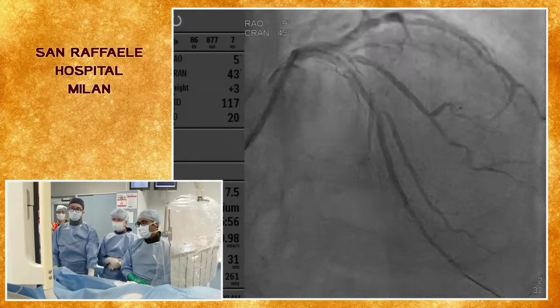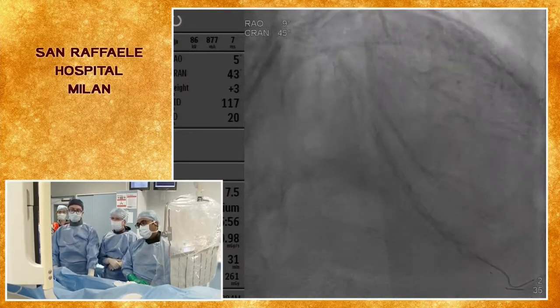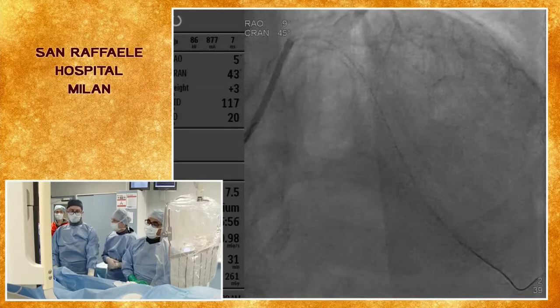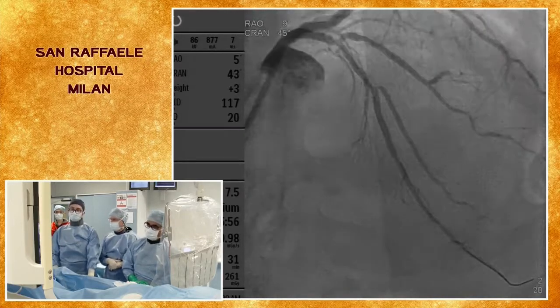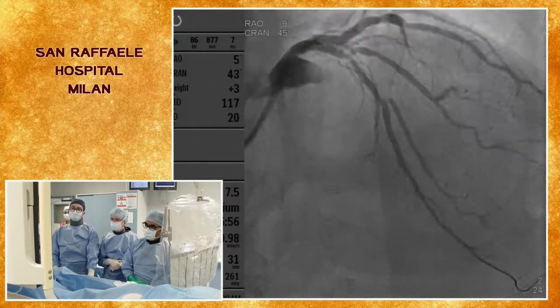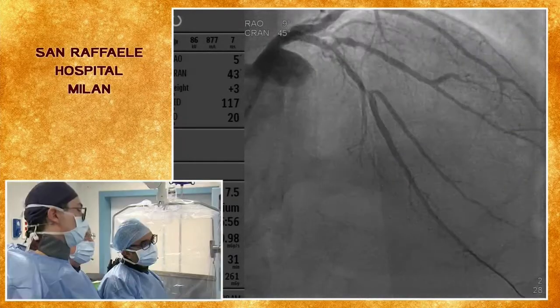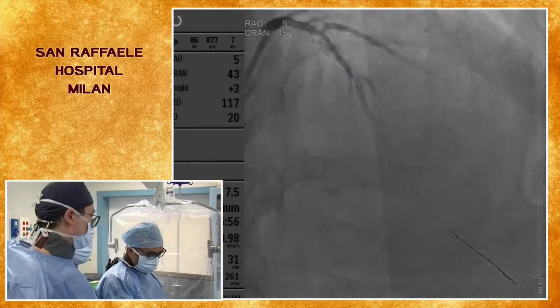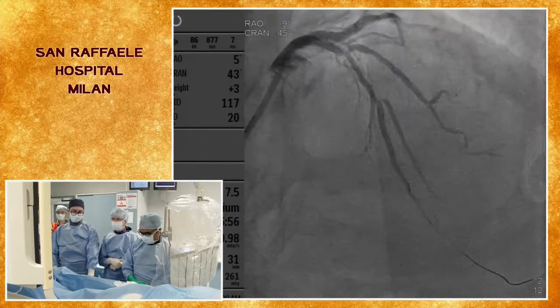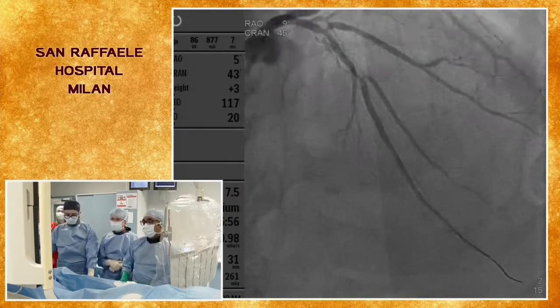So our approach is a little bit unconventional in this case because it's not common. My suggestion was to do a single stent from the LAD towards each diagonal, and then maybe consider a drug eluting balloon in the distal part of the LAD, in order not to place two stents. Of course, the final decision will be after the kissing, and it depends how good the result is in the LAD. Azim already placed three wires.